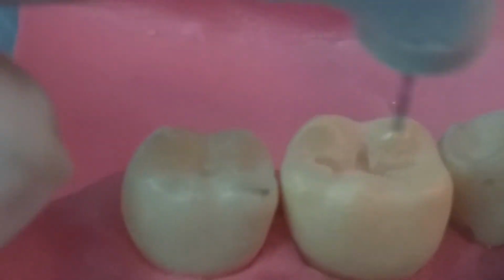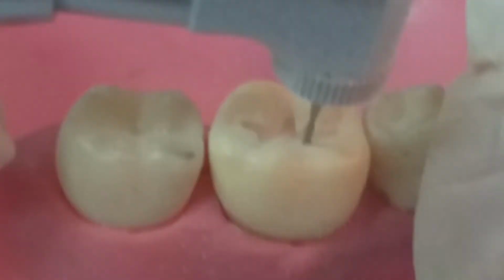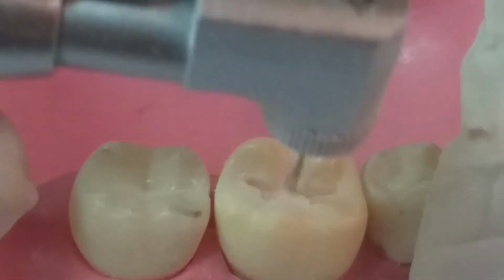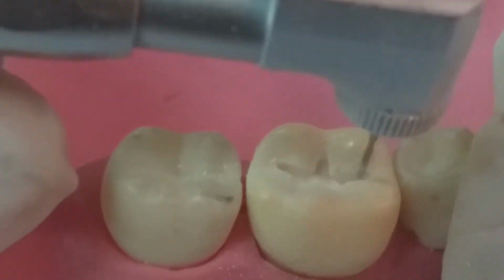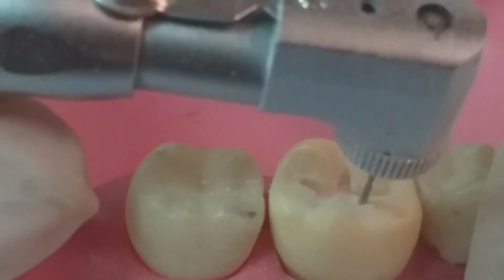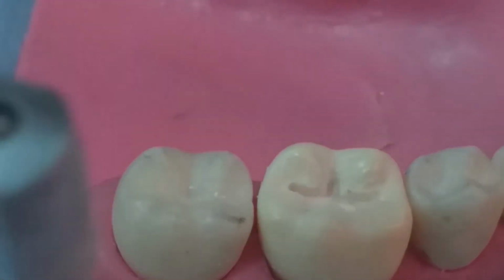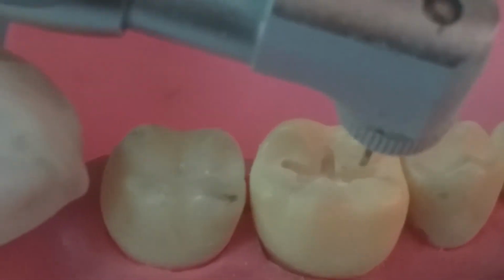Here smoothing the wall and making it round to remove all sharp points that will cause stress concentration that leads to fracture of our restoration. This is important. We must follow the principles of preparation to make a good restoration.